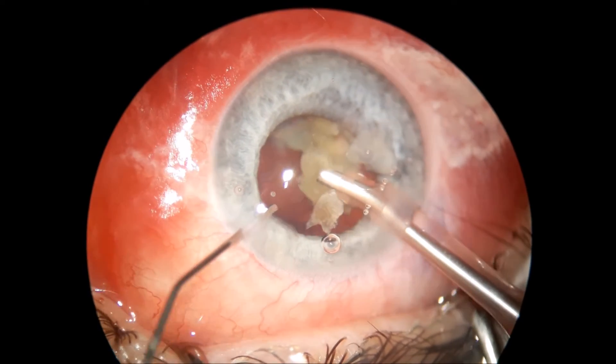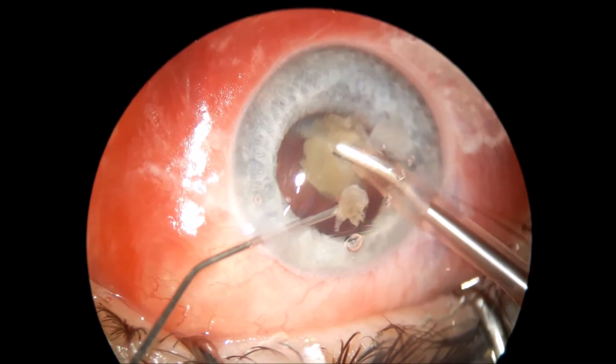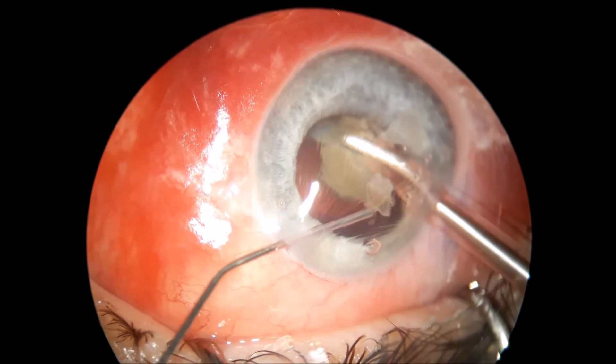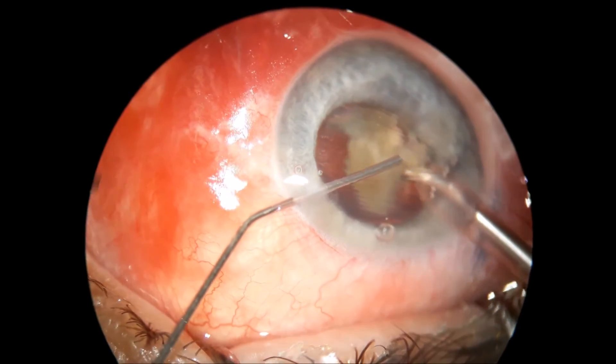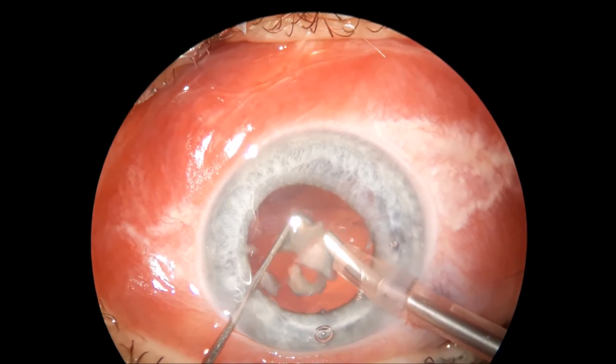One of the cortex and epinucleus pieces is getting stuck to the cornea because of that viscoelastic, but it is very easy to aspirate and clean out the bag real well.